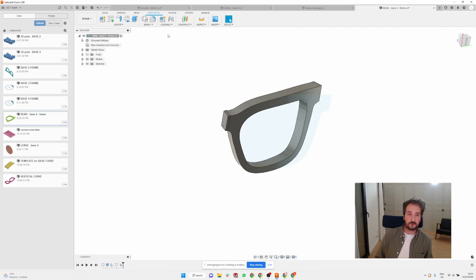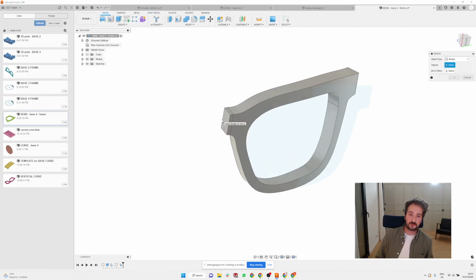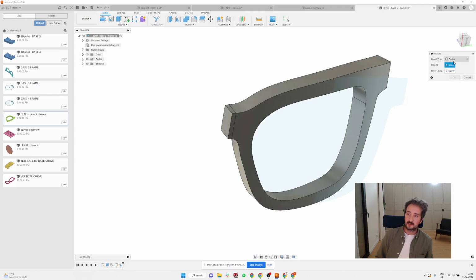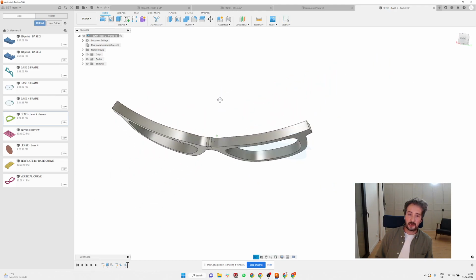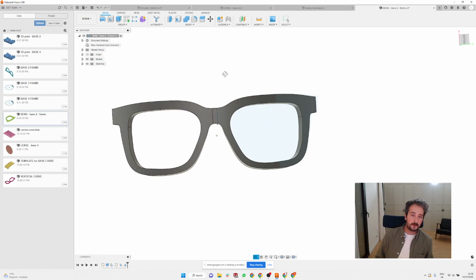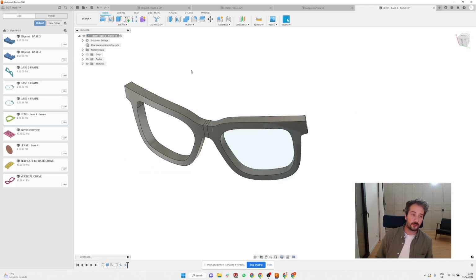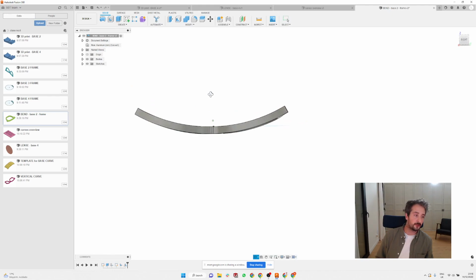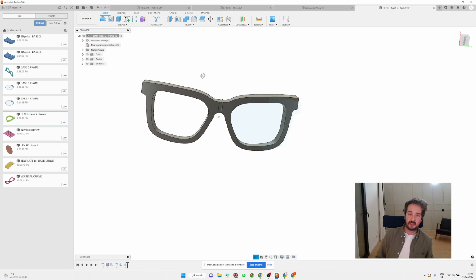And if I go back to the solid and mirror the whole thing, I'm going to select this body, and this is going to be my mirror plane. So now I basically have the frame which has the base curve 4 on the lenses, and overall it's also base curve 4. So that's basically how you make the base curve 4.